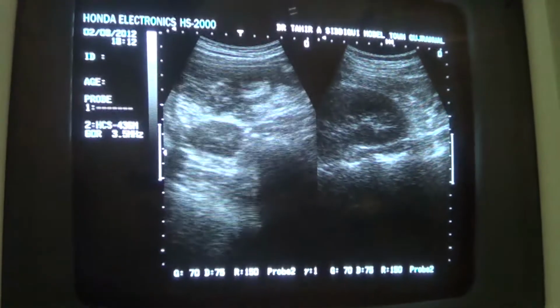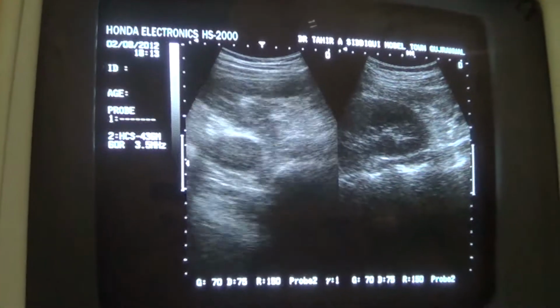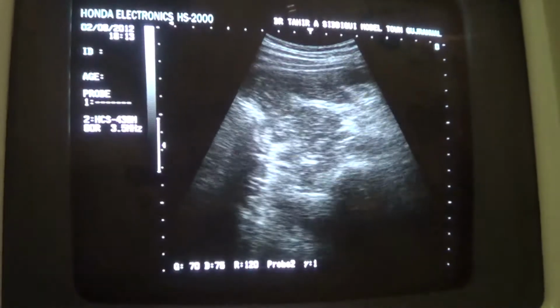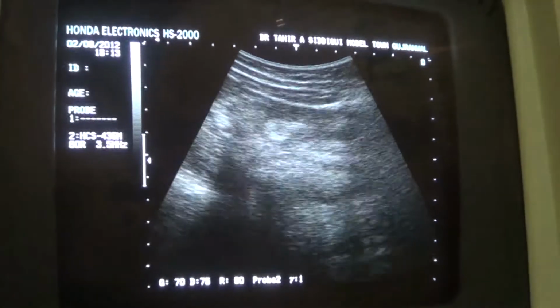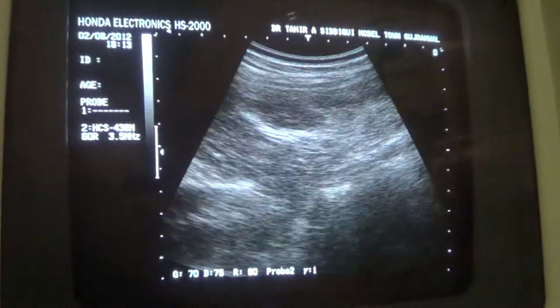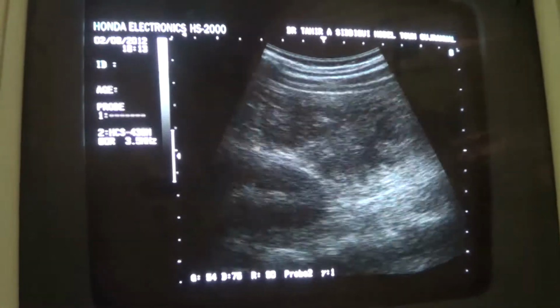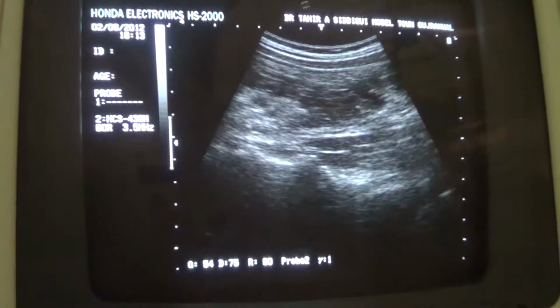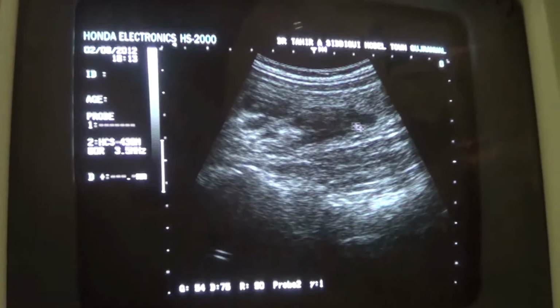Now coming down from the transverse section, to the lower area, lumbar region, with the patient supine, moving the probe downwards, magnifying the image a little bit, and then coming down straight. Here it gives you an impression of fluid. Now on the left side, this is the psoas major muscle. This is the paracolic gutter. Above it, there is a very small amount of fluid in the left paracolic gutter. This black area.